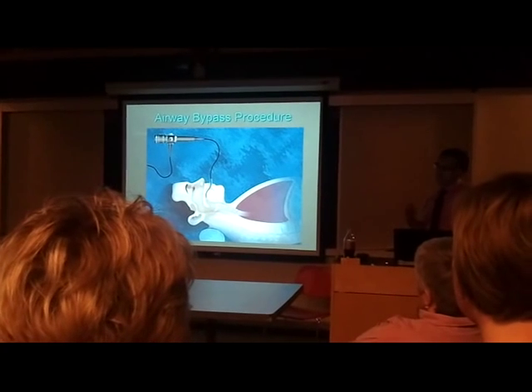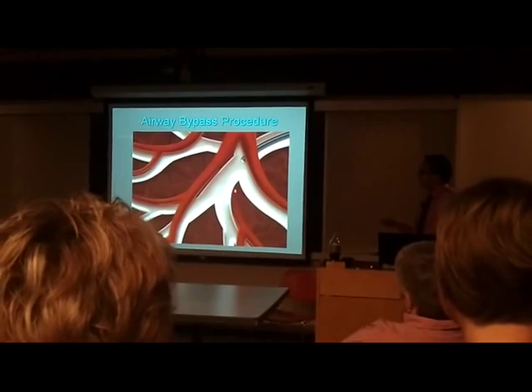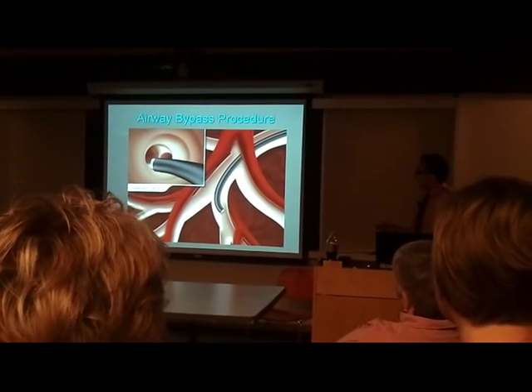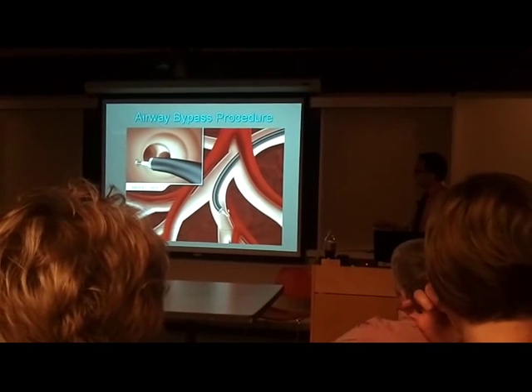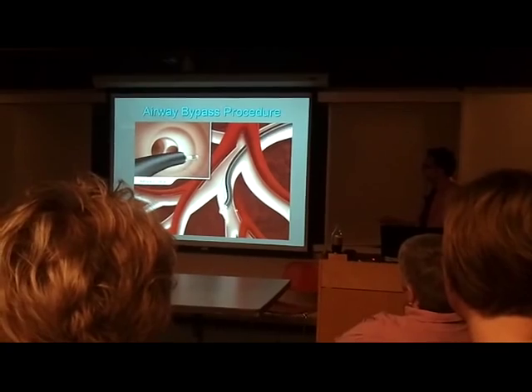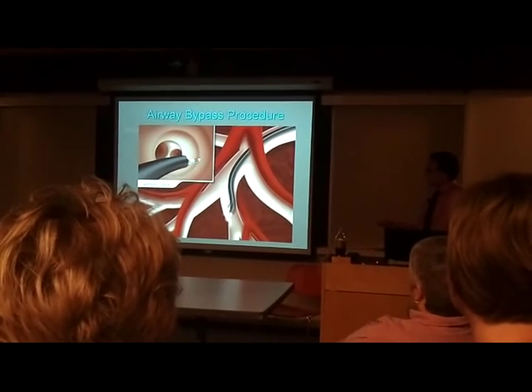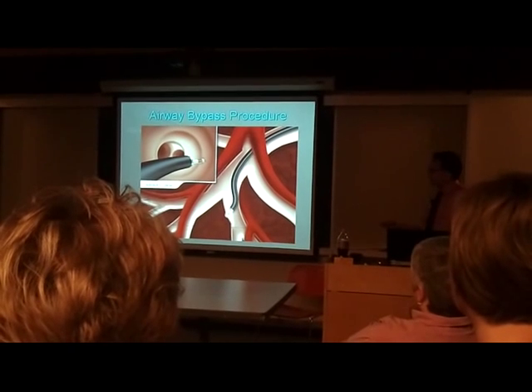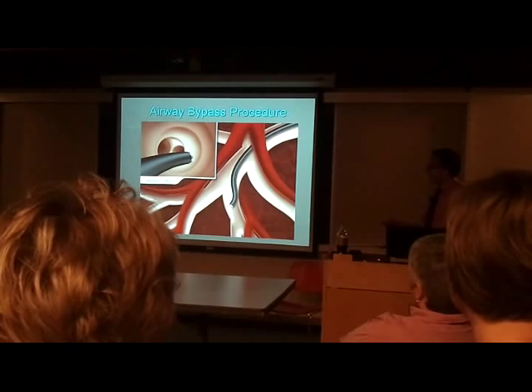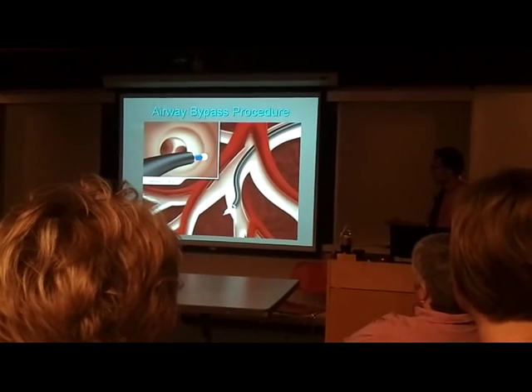So this is how the procedure is done. Again, flexible bronchoscopy, no surgery, under general anesthesia. You go in with the bronchoscope, and first we put a Doppler probe to see where the blood vessels are. The Doppler probe tells you if you are towards a vessel. If you are, you change the site and you Doppler again, it's just a sound Doppler. If there is no blood vessel there, then you're safe to go ahead and make a tiny hole in the airway. And then pass a little catheter and inflate a balloon.